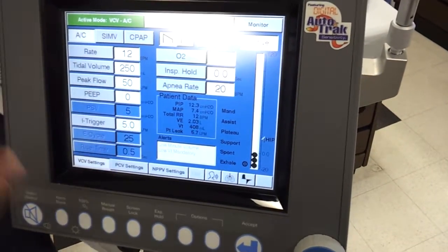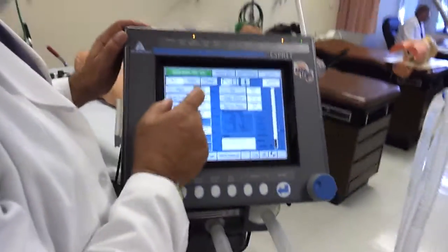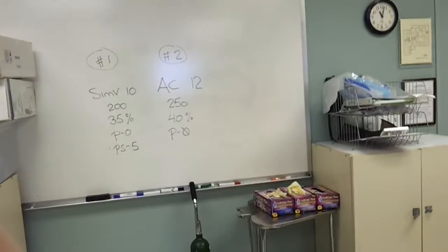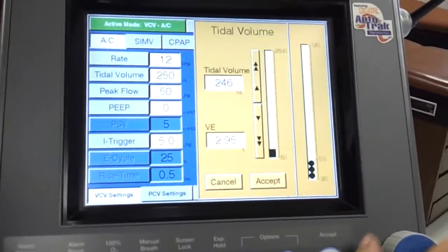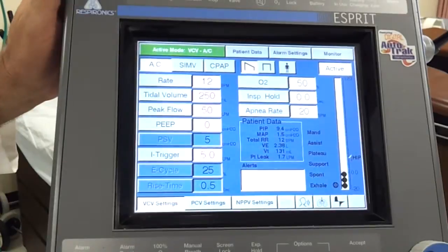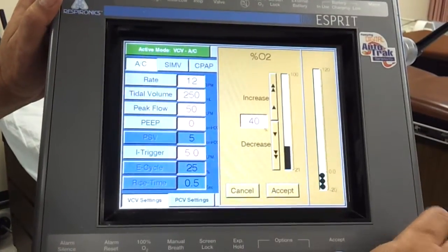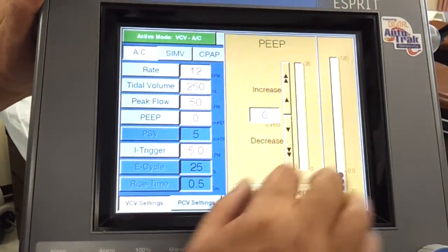So we're on volume control. I need to put in my doctor settings. Let's say the doctor's orders are assist control 12. I'll go up here and go with AC — it's on AC. Rate of 12, accept. Tidal volume of 250 — I hit tidal volume and put in 250. You can either turn the knob or hit these little arrows to go up and down, whatever you prefer, then hit accept. Forty percent FiO2. And a PEEP of zero — so PEEP is zero. So those are all my doctor settings.